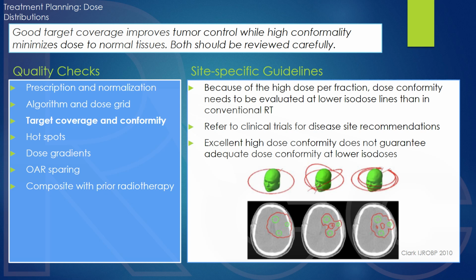And the red line is most compact with the non-coplanar beam arrangement. And you may be thinking, well, you're not showing me the dose outside of this plane where there's exit dose for non-coplanar. That's true. But take my word for it, the volume of this red line is absolutely smaller using the non-coplanar beams. And for that reason, we strongly recommend non-coplanar beam arrangements for SRS.